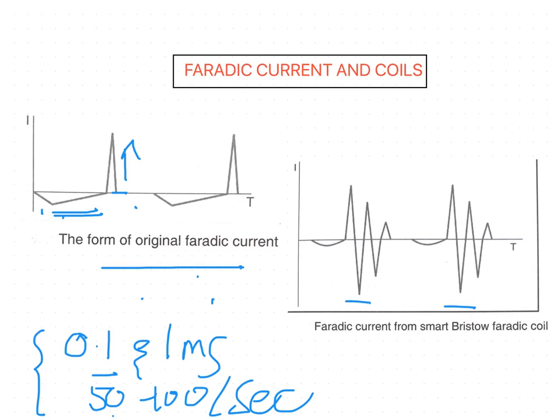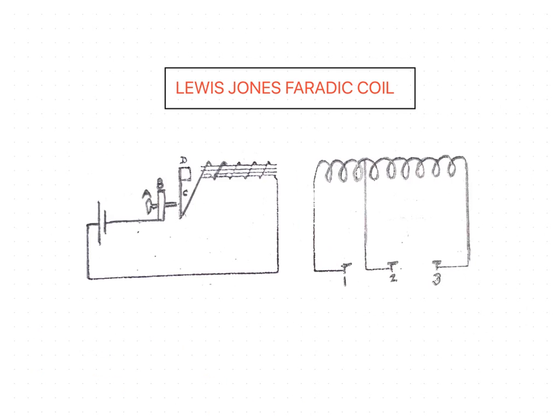Now first we will see the Lewis-Jones Faradic coil. Yes, here comes the Lewis-Jones Faradic coil. This is the original type of Faradic coil, and although it is no longer used for the treatment of patients, it illustrates the working of a simple induction coil.